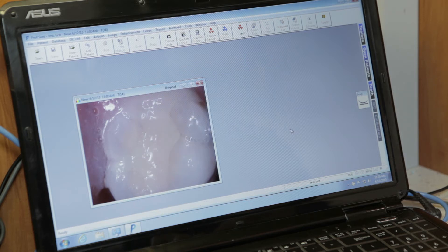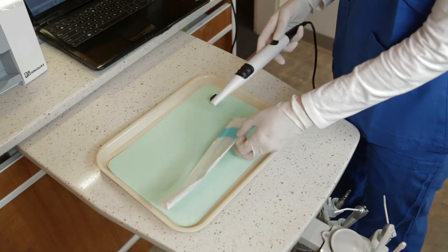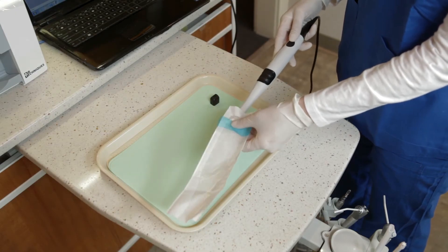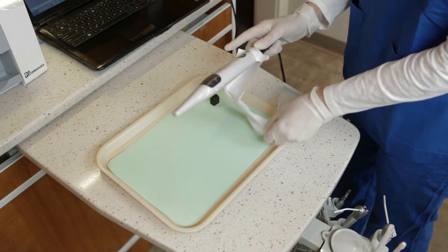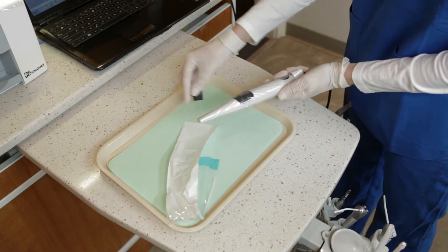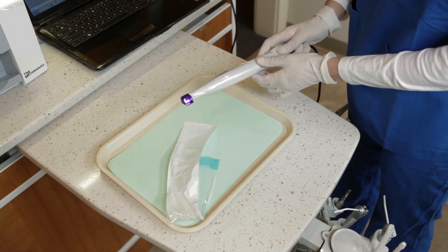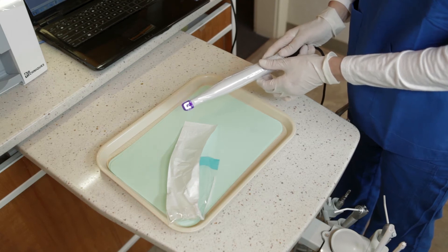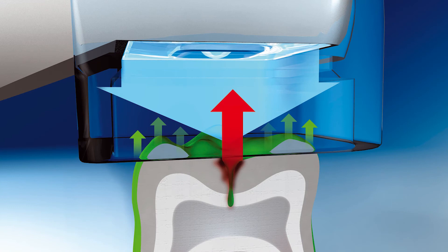We will end the examination with Spectra Caries Detection Aid. Place the sleeve over Spectra's handpiece just as we did with Polaris. Next, attach the spacer with the rounded part going over the top of the handpiece. Make sure that all six LED lights are visible and not covered up by the spacer. The spacer allows you to maintain a consistent 10 mm distance to the tooth surface.